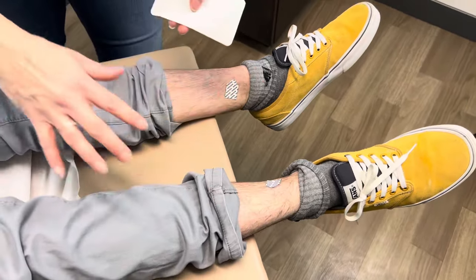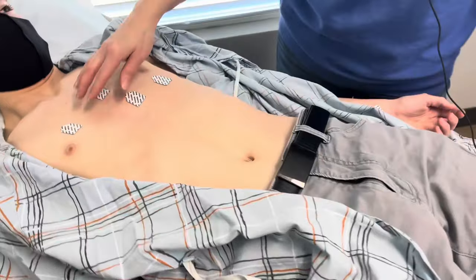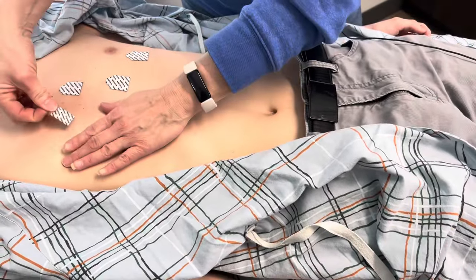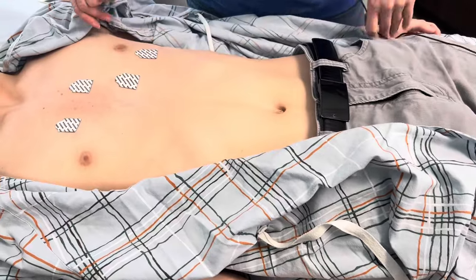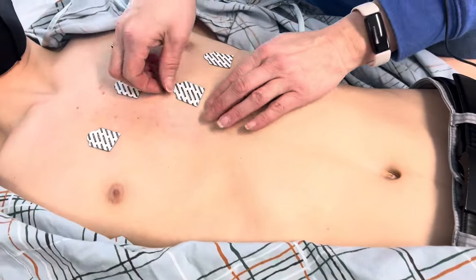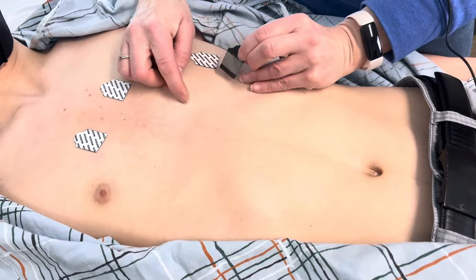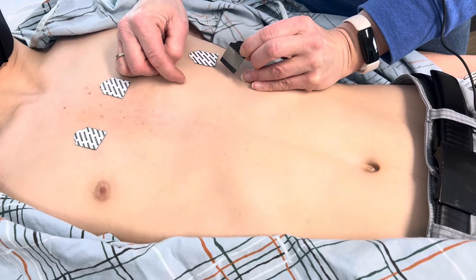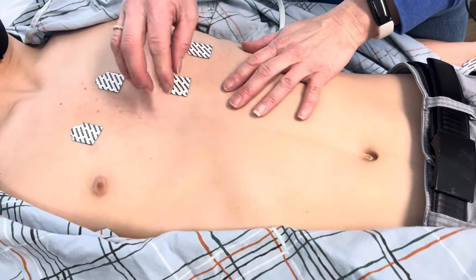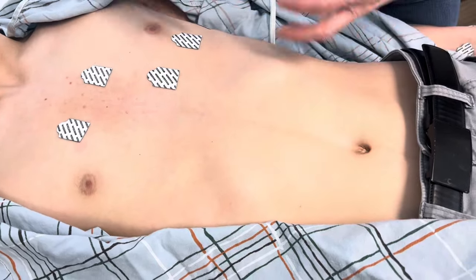Now that's the setup. Make sure all of those preparation steps — no hair, no grease, no lotion — are done before you do it. There's also data that if you can't get it to stick or the patient has really dry skin, you can scratch the skin a little bit to roughen it before applying the lead. Remember, any kind of movement will interfere with the electricity we're picking up.